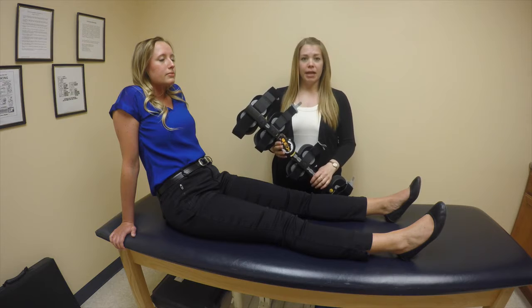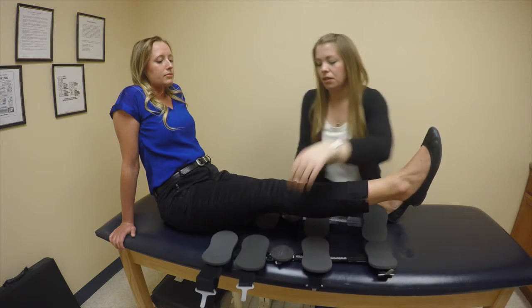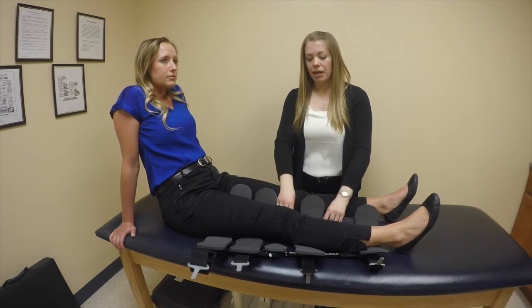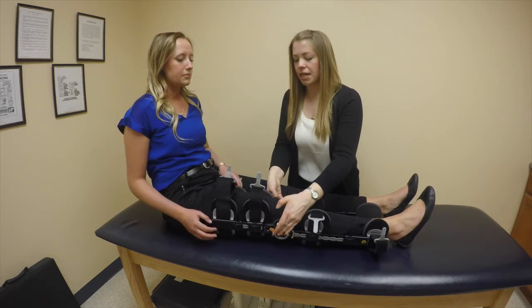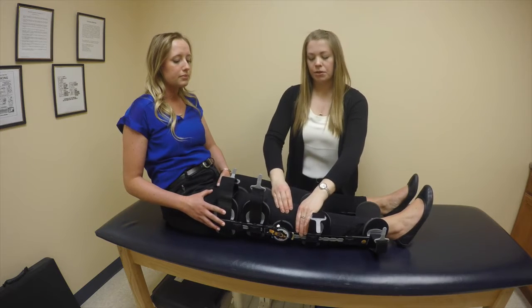When you're ready to apply your brace, you'll start by opening the brace and you'll slide it underneath your leg. Your leg should be on a flat surface so that you're able to keep the leg extended while you're applying the brace. You'll pull the stays up on either side of the knee so that the hinges line up with your kneecap.